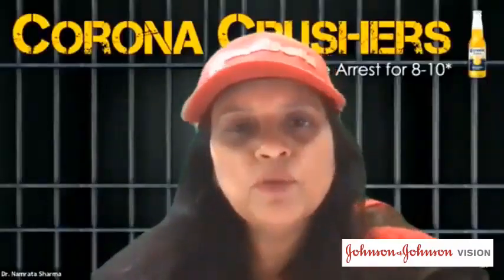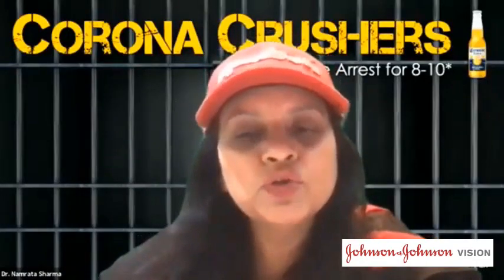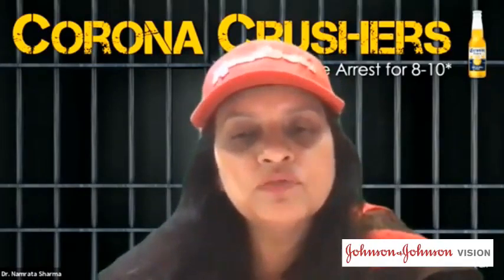Mahipal. I have a question for Priya. Priya is there. Priya, yes. This is from Dr. Harsh Kumar. He wants to know, is there any data on your visual field analyzer where you've seen how the visual fields progress?